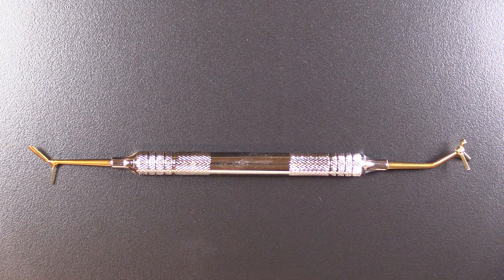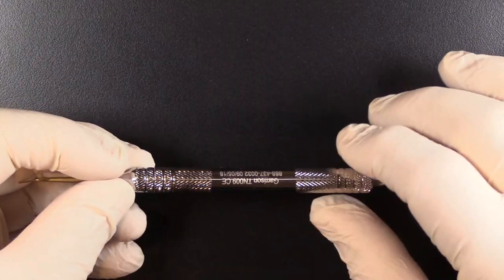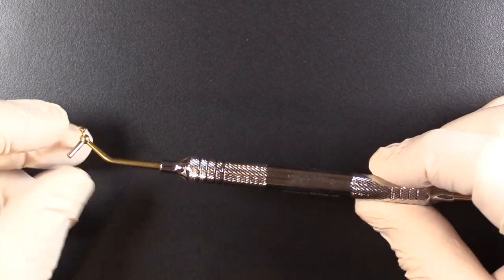Hi, this is Kevin with Garrison Dental Solutions, and I want to show you just a little bit about something that is one of our most popular inventions that we've ever come out with — what we call the TN-009 Multifunction Composite Instrument. This is our latest generation of this instrument.